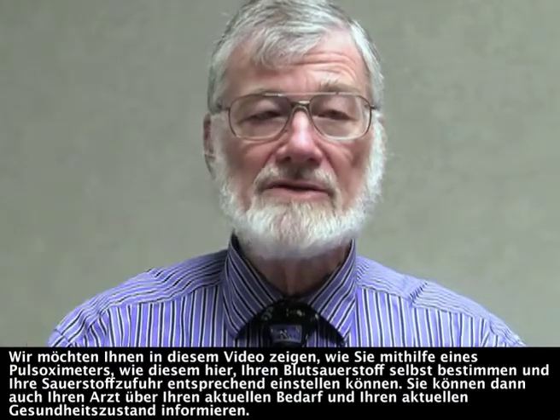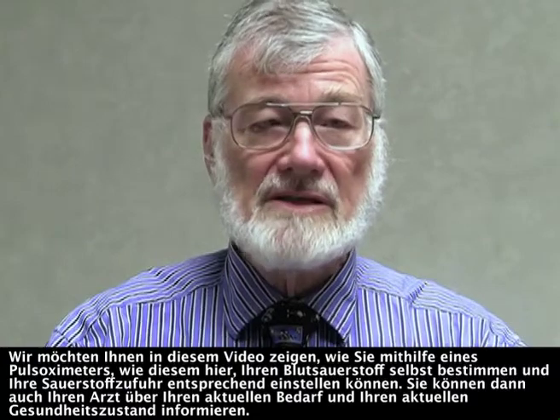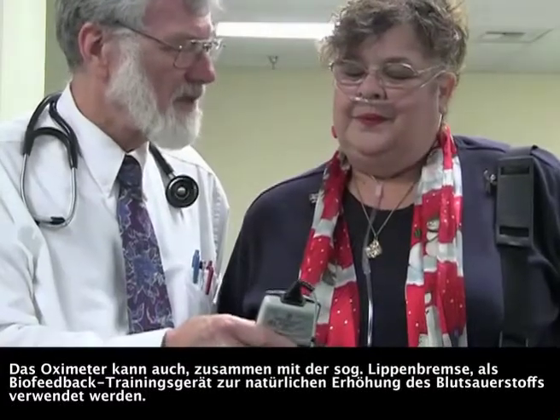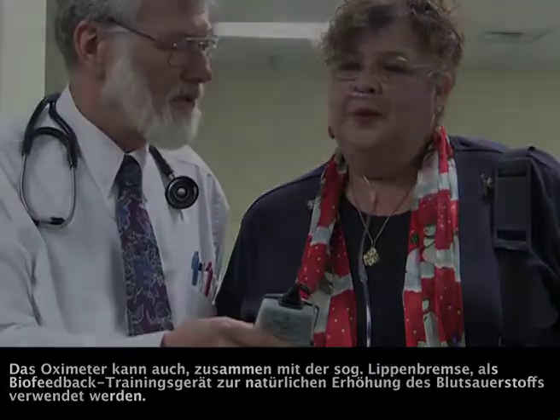In this video, we describe and demonstrate how a pulse oximeter like this one can be used to measure your oxygen level, to adjust your oxygen setting, and to inform your doctor of a change in your condition. In addition, the oximeter can be used as a biofeedback training device along with pursed lips breathing to increase your oxygen level.